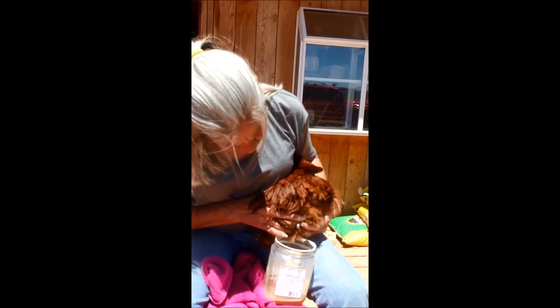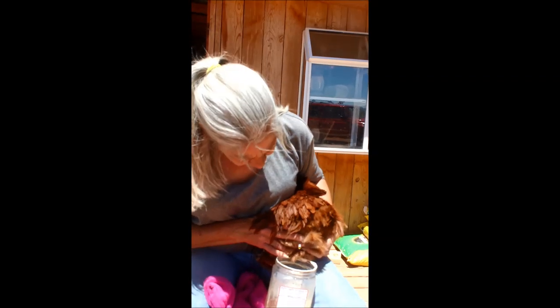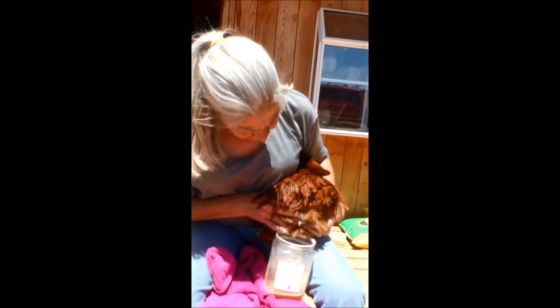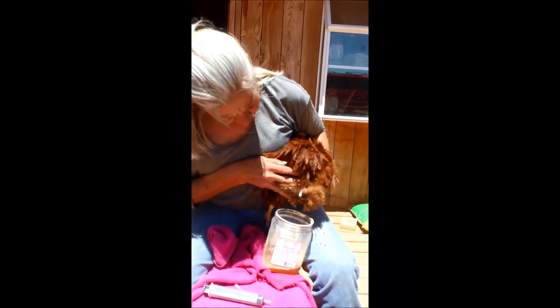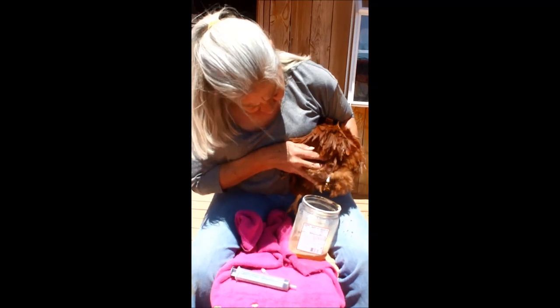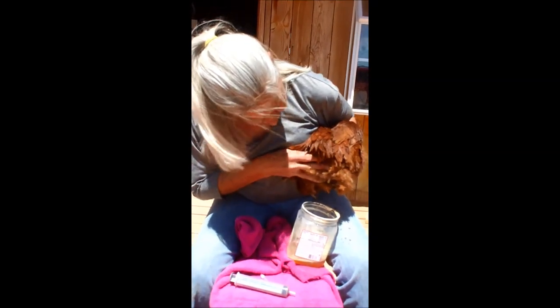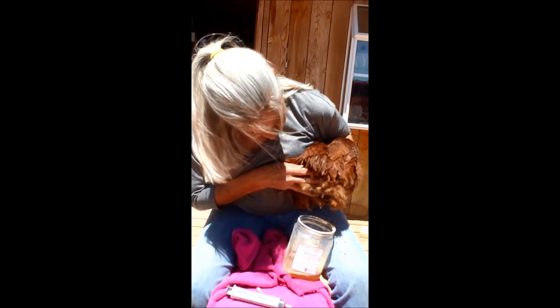If they go to the vet, it'll be diagnosed as a heart condition maybe, or a liver condition. And basically the body is just building up fluids around that area. This chicken may not have to have this done again for 2 years. But then again, once you start it, you may have to do it every 3 months. It just depends. Now, I can feel that there's still probably a cup full of fluid inside her, and I could draw it all off, but I don't want to stress her.